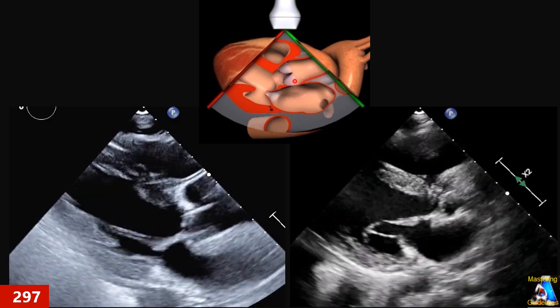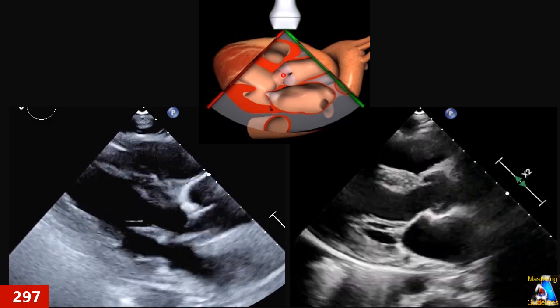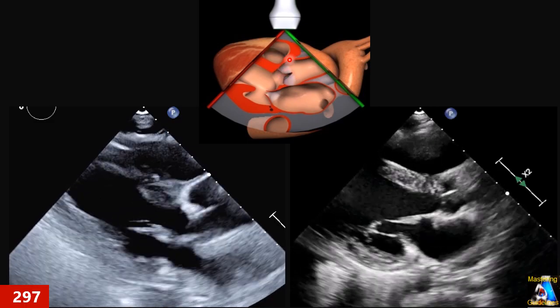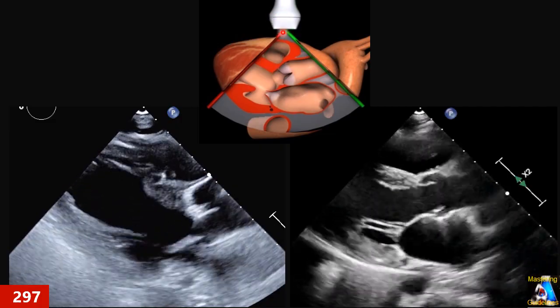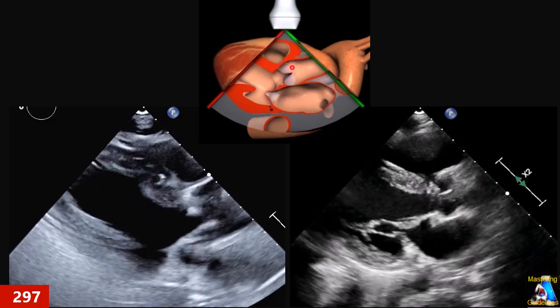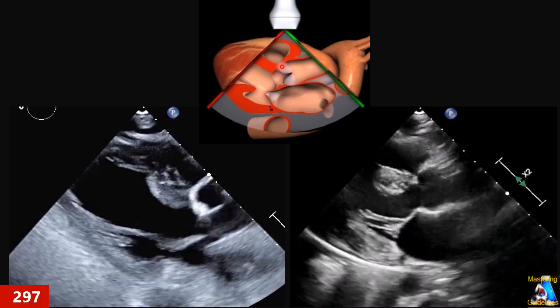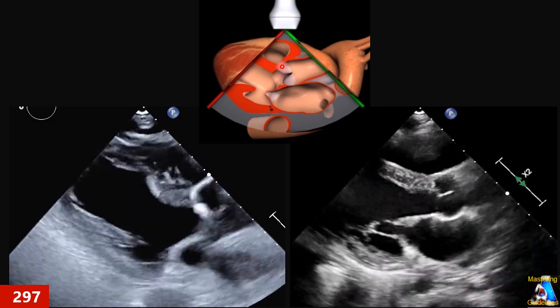But in practical terms, you know that many patients don't have a good window at the level that we want, because it should be here at the center, exactly at the aortoventricular junction. But many patients, when we scan, that spot doesn't give us a good image, and we have to move.